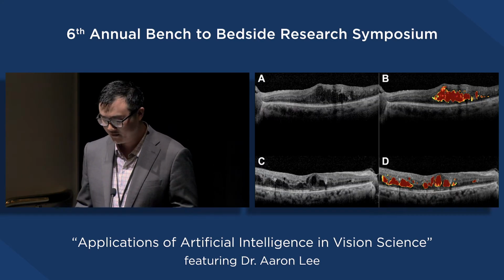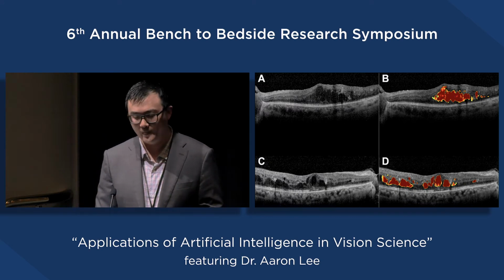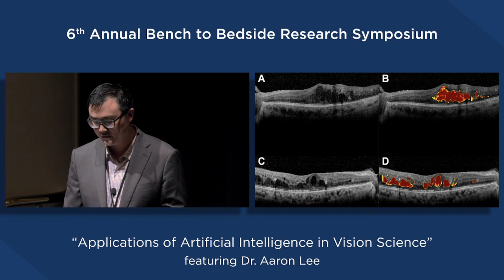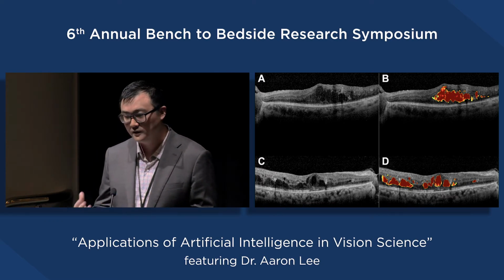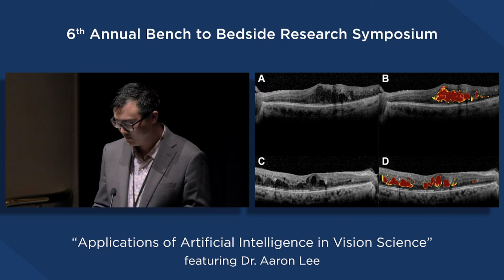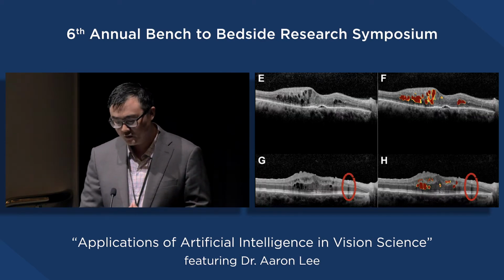But seeing is believing, right? So here are some examples. On the left is the original OCT image that was not in the training set. On the right are the color-coded confidence of the model calling that intraretinal fluid. And here are 2 more examples.